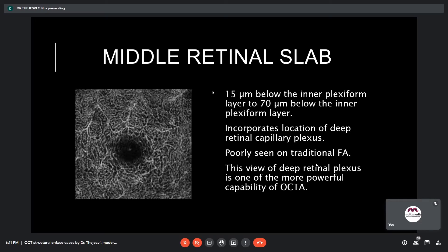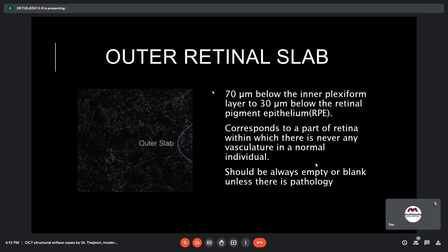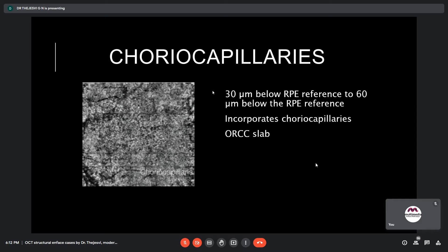The outer retinal slab starts at 70 microns below the inner plexiform layer to 30 microns below the retinal pigment epithelium. It corresponds to a part of the retina where there is normally no vasculature — in a normal individual this should always be empty or blank unless there is pathology. The choriocapillaris slab starts 30 microns below the RPE reference to 60 microns below the RPE reference, incorporating the choriocapillaries. The ORCC slab combines both the outer retinal and choriocapillary slabs and is used in some machines.